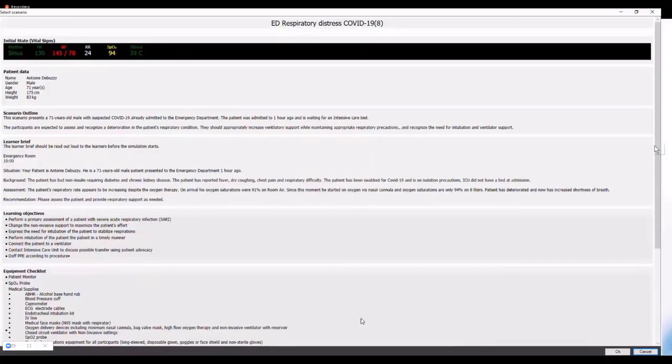We have written a learner brief there as a guide. You may want to change this if it doesn't suit your local area. The emergency room, it's at 10 o'clock in the morning. Your patient is Anthony DeBuzzy. He's a 71-year-old male presented to the emergency department 1 hour ago.